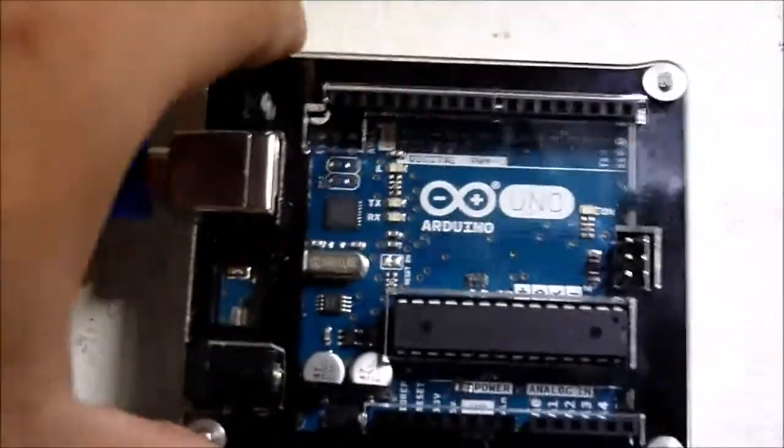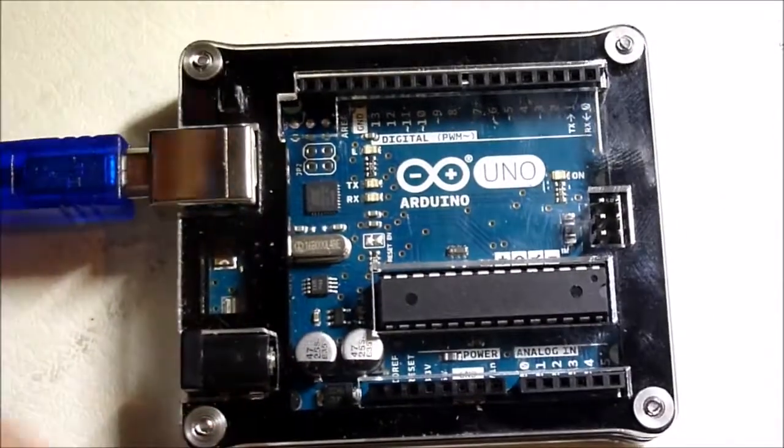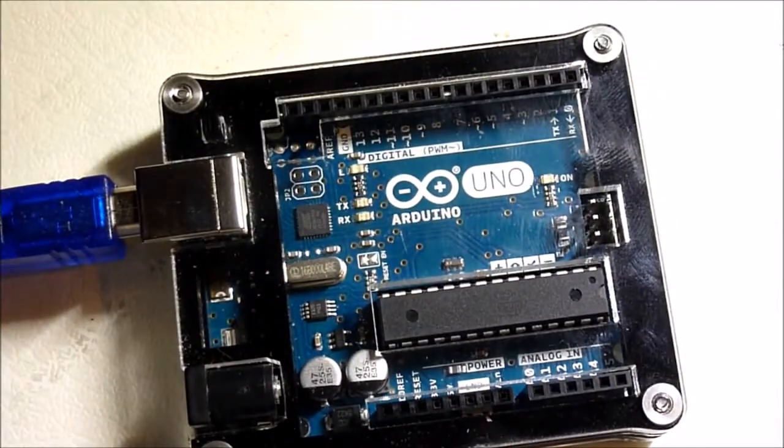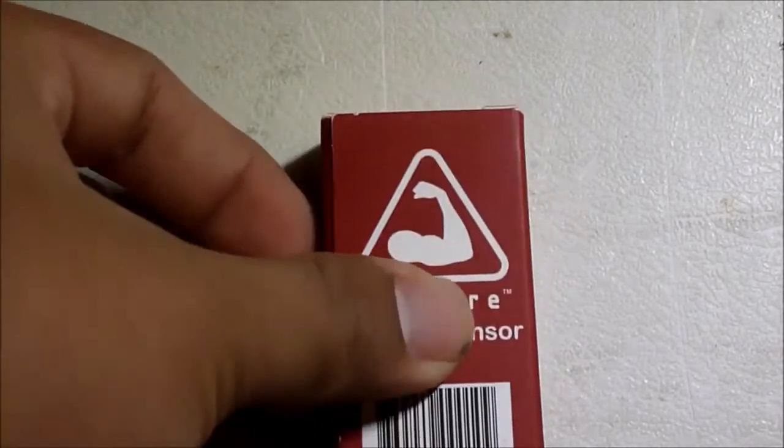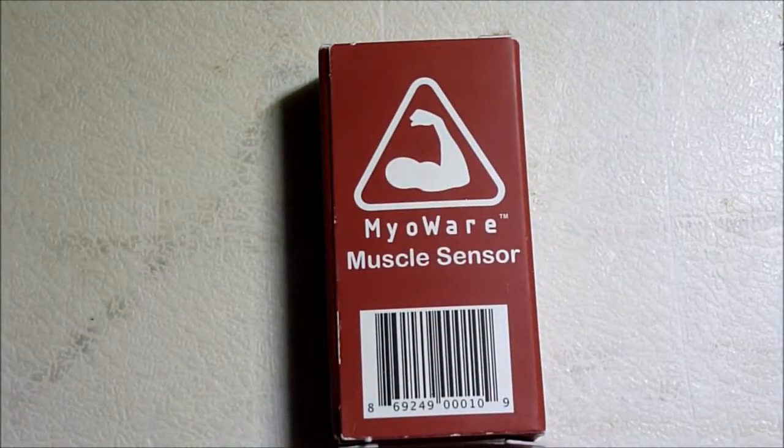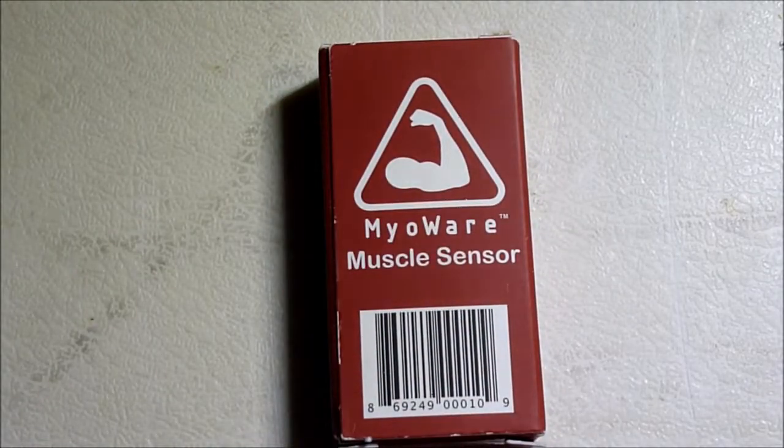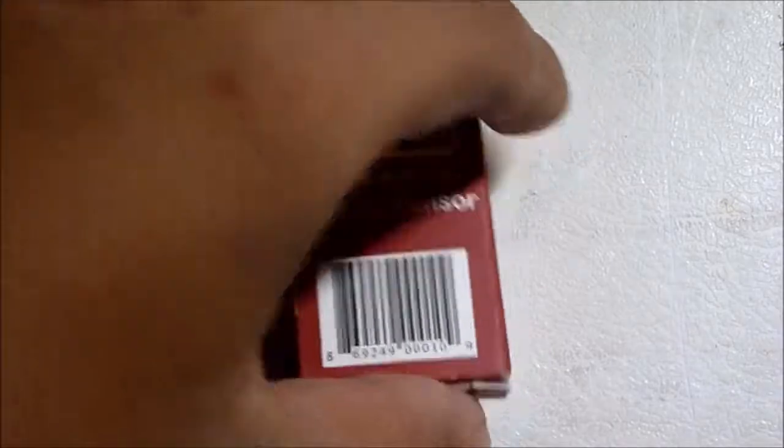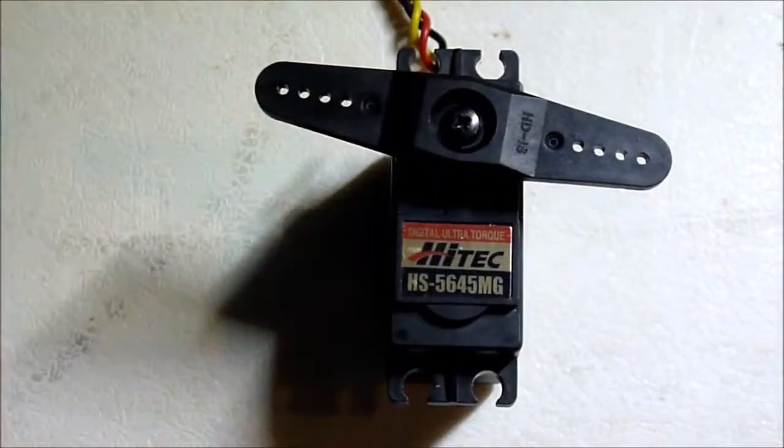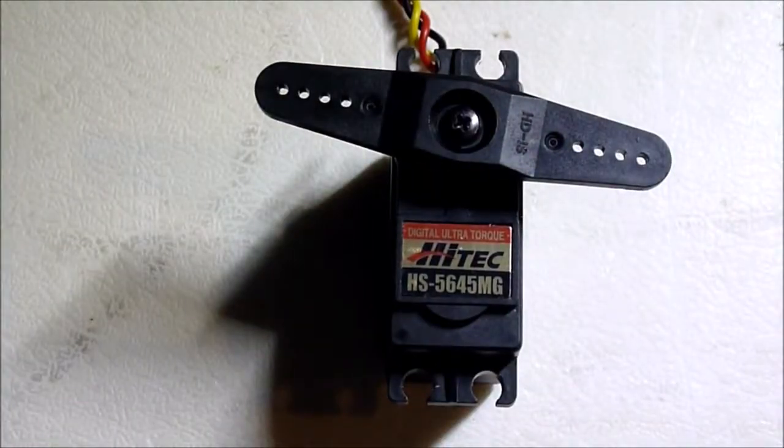So today I'm using an Arduino Uno, a Myoware muscle sensor, and a high-torque servo.